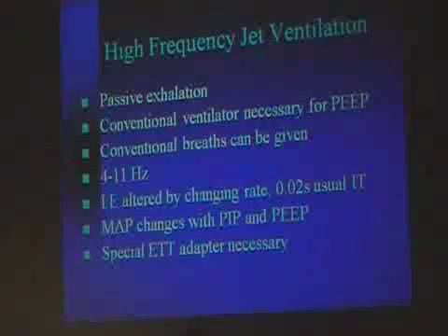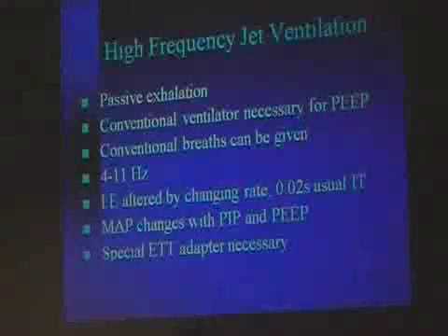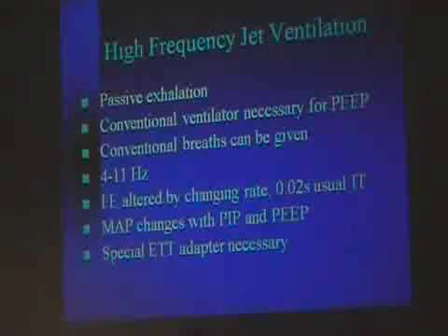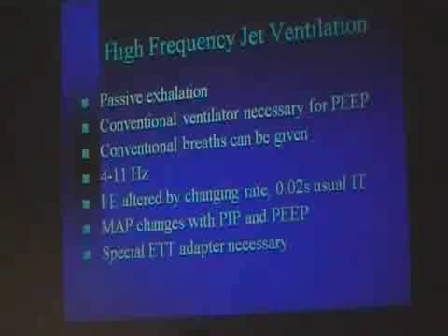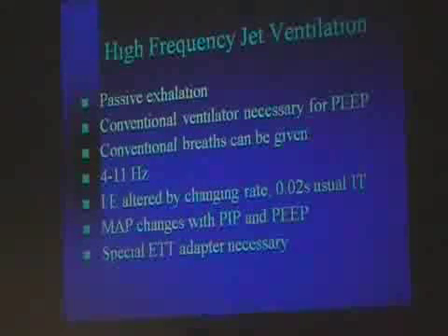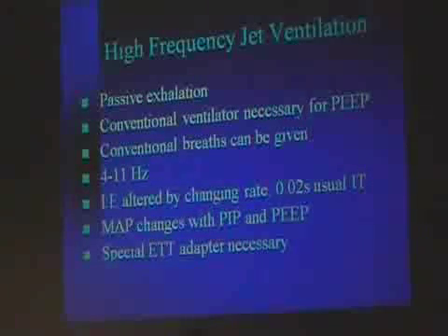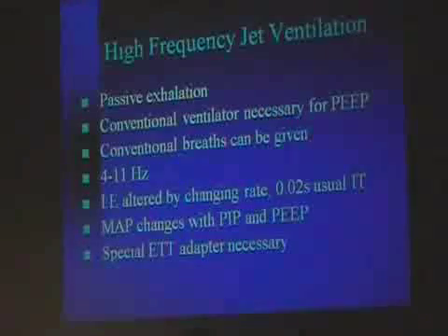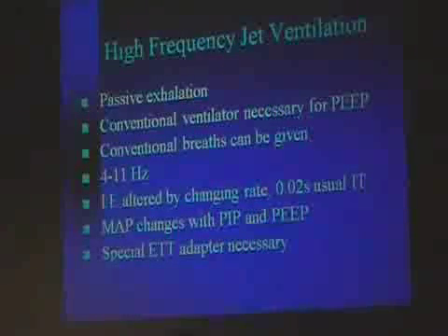We'll talk more about that next time, but the whole purpose of high-frequency ventilation is to try and move away from tidal ventilation. We talked about the dangers of volume trauma, of shear injury, of stretch injury, of overdistension, of atelectasis. And the whole purpose is to try and ventilate and oxygenate without tidal ventilation.